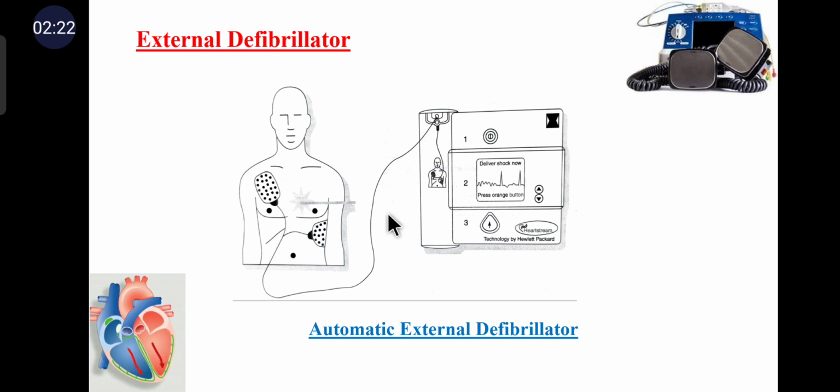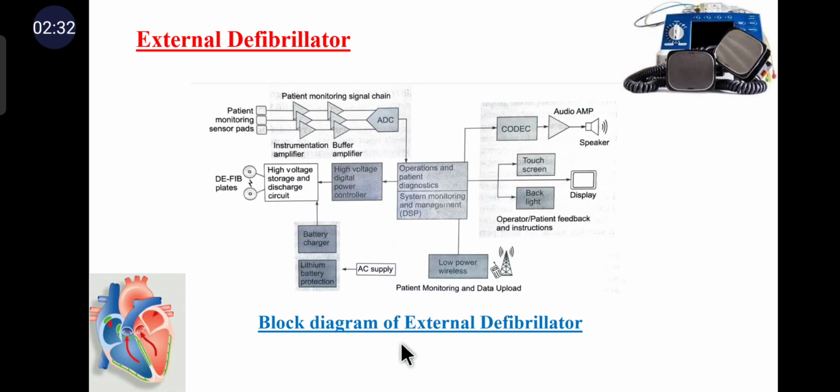It was initially thought that different self-adhesive electrode designs were needed for defibrillation, pacing and monitoring. So this is a block diagram of the external defibrillator, a highly sophisticated microprocessor unit that monitors the patient and automatically treats life-threatening heart rhythms. It captures the ECG signals from the electrodes and runs the ECG analysis algorithm to identify shockable rhythms and then advises the operator whether defibrillation is necessary or not.